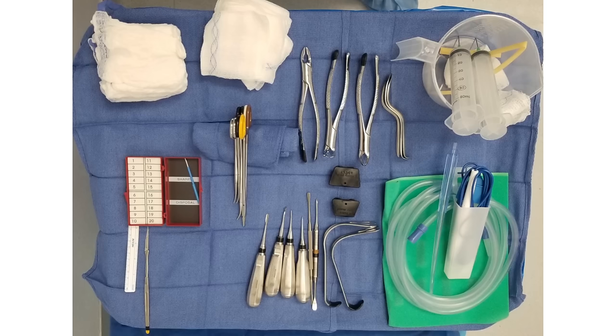This is a lower, what we call a cowhorn forcep. I think you can see that the tips look like a cowhorn. This is an upper universal forcep. These are Minnesota retractors. It looks like there's actually three of them there. That's a cheek retractor. These are our irrigation syringes. They've got the blunt tip needle on them.